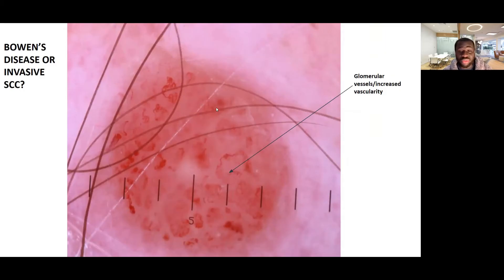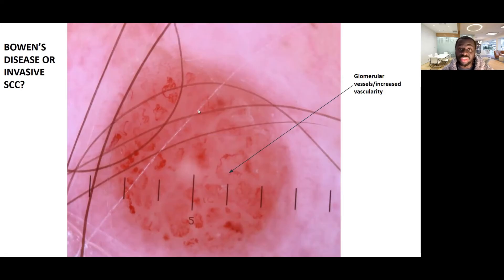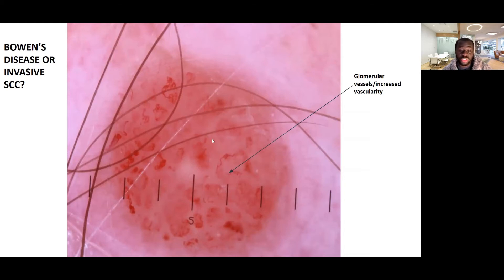Would we say this is a Bowen's disease or an invasive squamous cell carcinoma? Look at this lesion — it looks roundish, a circumscribed lesion. This is likely to be a Bowen's disease, which is a squamous cell carcinoma in situ — a pre-malignant lesion that could transform into a squamous cell carcinoma. You could see these blood vessels having a roundish glomerular pattern, like the glomerulus of the kidney, which is typically found in Bowen's disease, even though this slide was labeled squamous cell carcinoma.